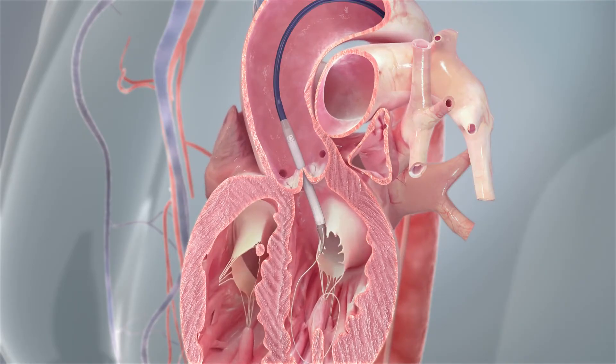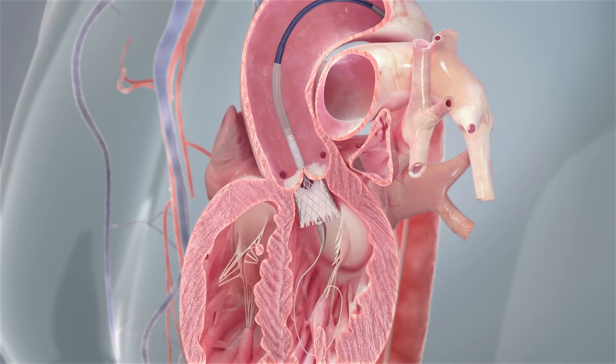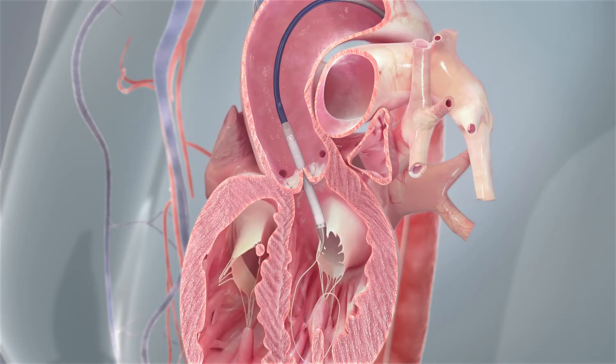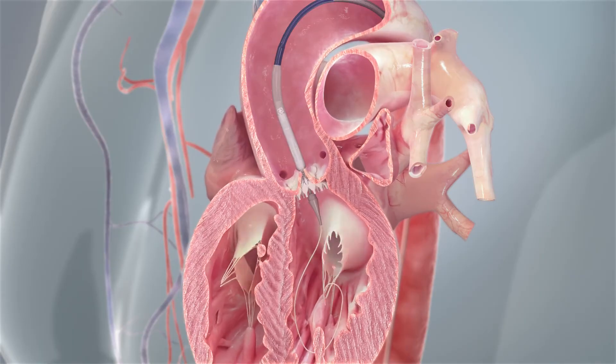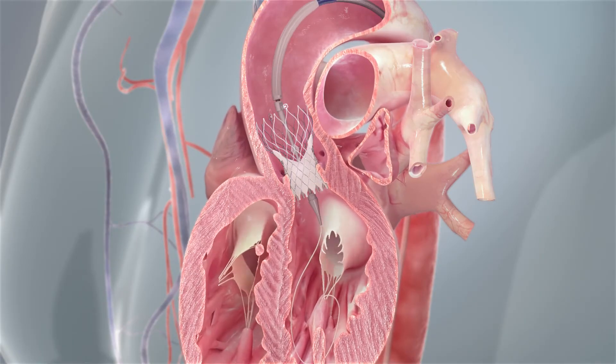Once the valve is into the heart, we release it. If it's not in the correct position, we can recapture it as many times as we like. Once we have it in the perfect position and we're happy, we release the valve.